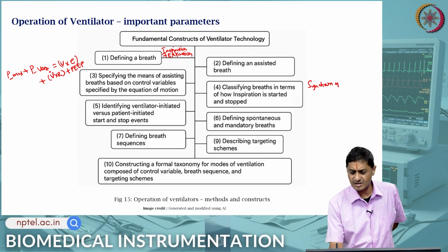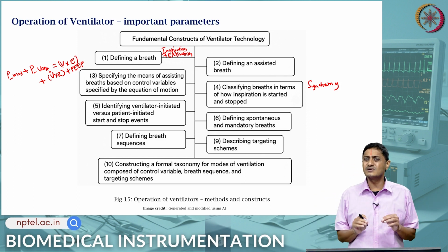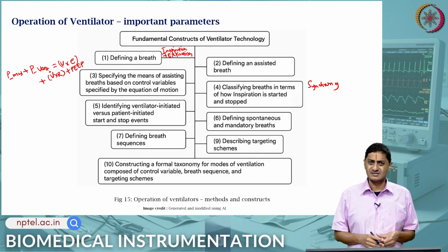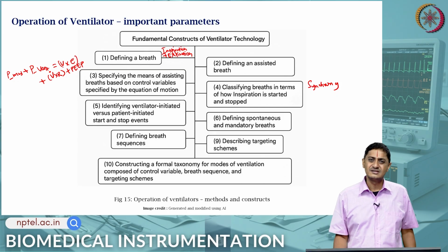It is not like one ventilation after another comes in quick succession followed by a gap. You need to be appropriately synchronized with the patient's requirement. Synchrony is needed, so that two breaths do not follow each other too quickly or are not too far apart in time. This is critical for patient comfort, otherwise it will cause patient discomfort.